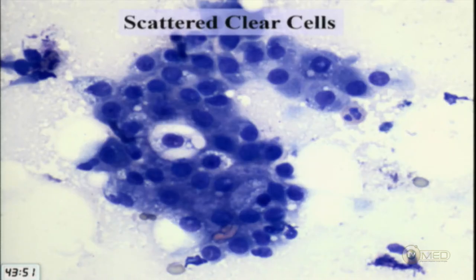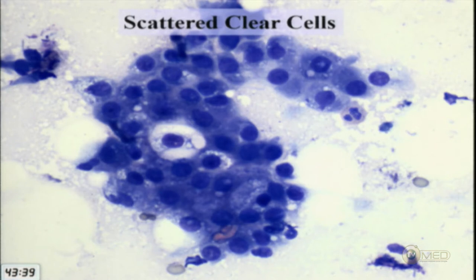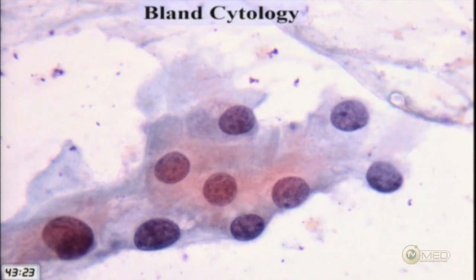Some cells surrounding a clear-cytoplasm cell had a vacuolated look. The question is: are these mucin-producing cells or sebaceous cells? If they're mucin-producing, I'm worried about mucoepidermoid carcinoma. It's a little difficult to know.